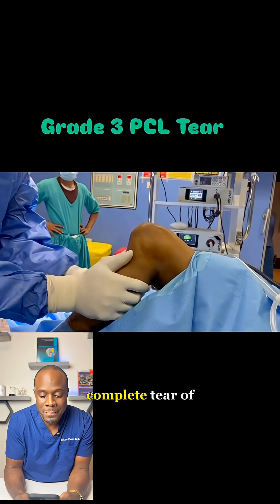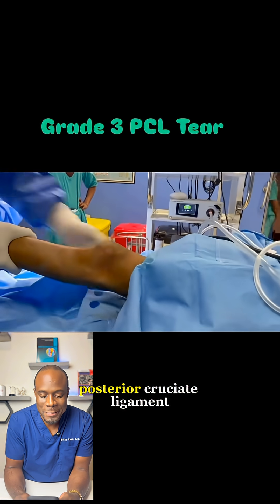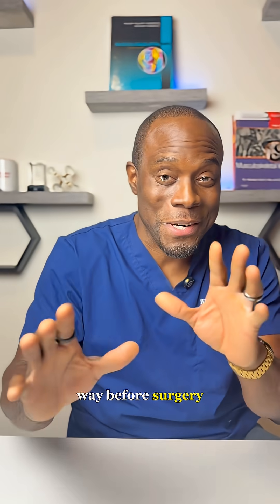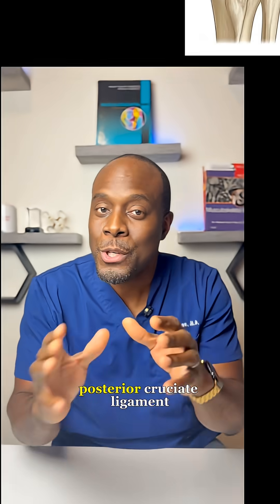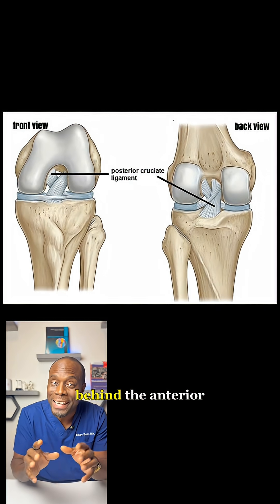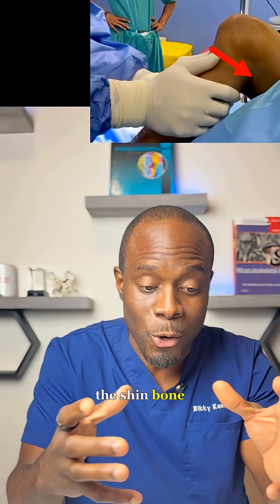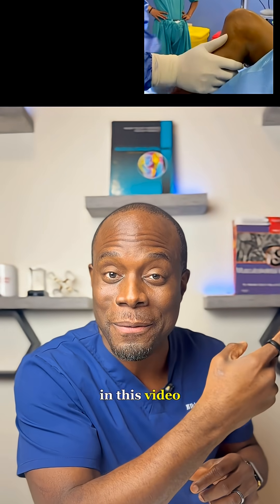This case has a complete tear of the posterior cruciate ligament. Let me show you how you diagnose this with MRI — way before surgery is needed — from the radiologist's perspective. The posterior cruciate ligament, or PCL, sits behind the anterior cruciate ligament, or ACL, and it stops the shin bone from sliding too far backwards, as we can see in this video.